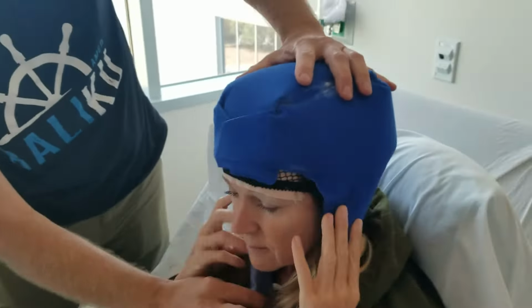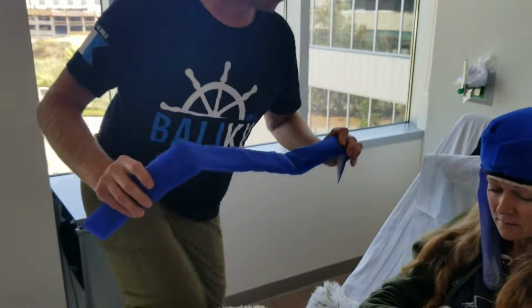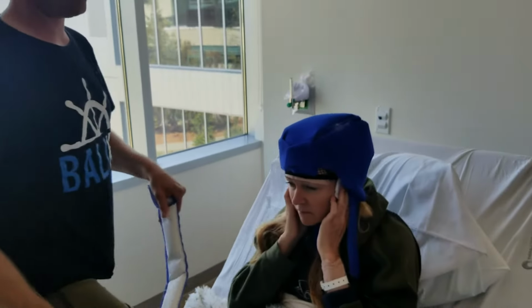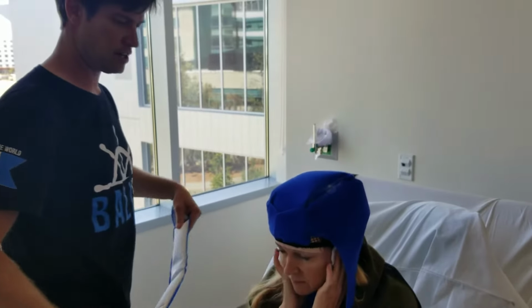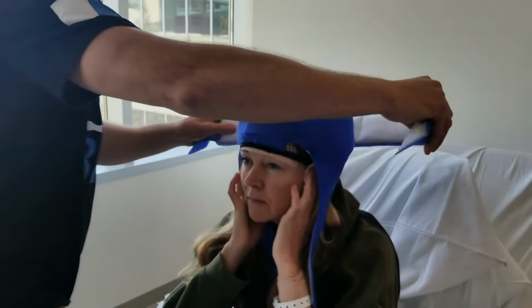As you can see, we didn't need this, but look at the gap you have here. You don't want that. And that's where this is a critical piece here, so it'll help you keep that hair from the side. So what you usually do is have you lift your head up. She's putting those little socks underneath her ears so she doesn't get frostbite. And those are just like cosmetic pads, right? Something like that. Lift your head up.